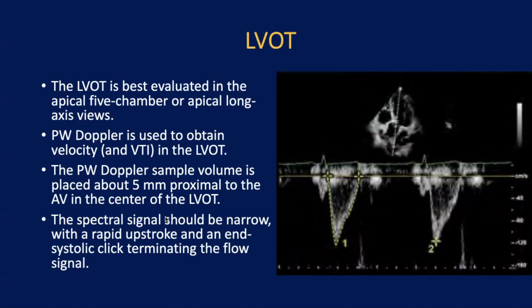However, if we take the annulus, you can go, they said, 3 to 5 millimeter below it, just to avoid the flow turbulence. They suggested 5 to 10 in the guidelines.